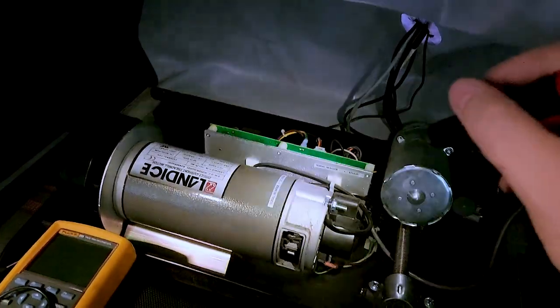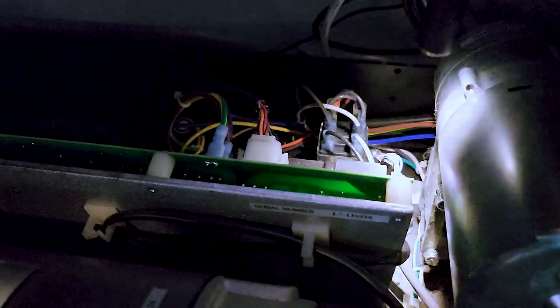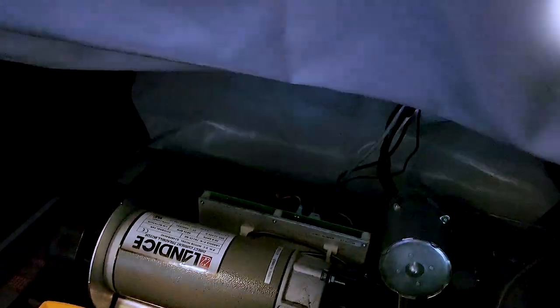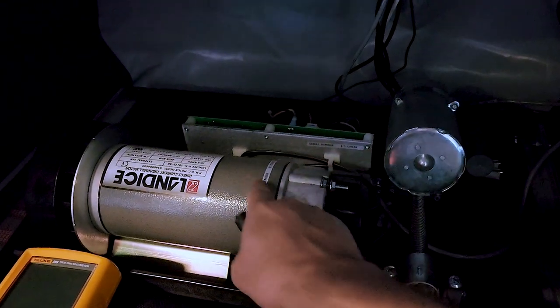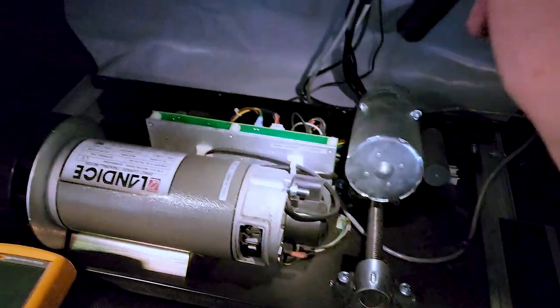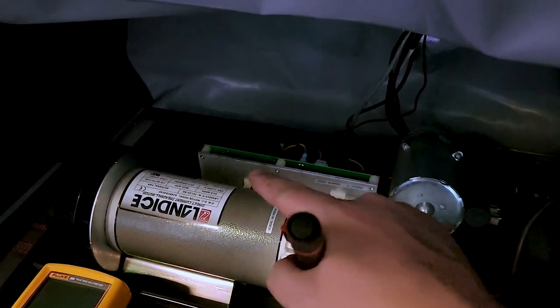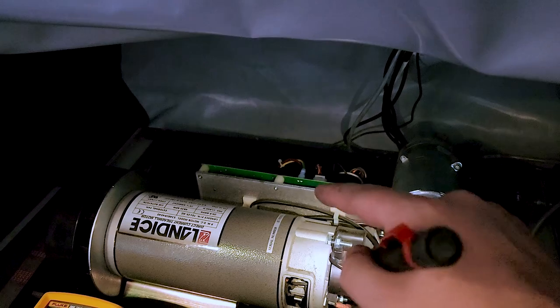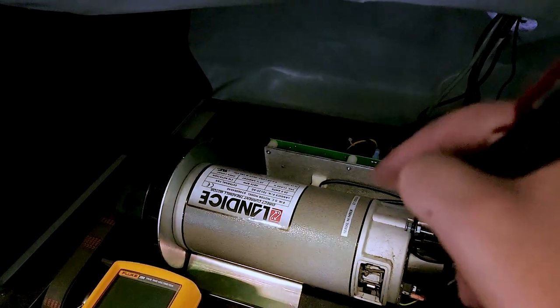Right here is the controller board, and here is the dilemma. You've got main power coming into the control board, and right here is your serial bus cable that comes from the controller — that tells this board to pulse DC to the drive motor or to turn on and control your incline. Since we have incline working, we can assume the AC on this board is fine, which means the chopper driver for the drive motor might be fine too. That's a little frustrating.